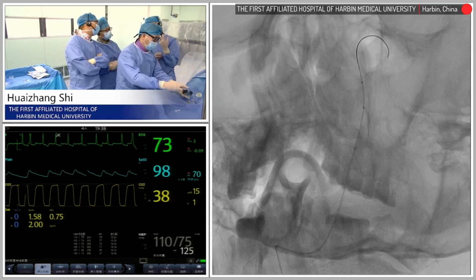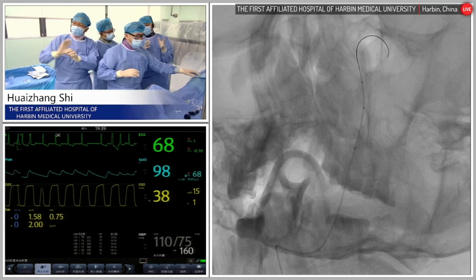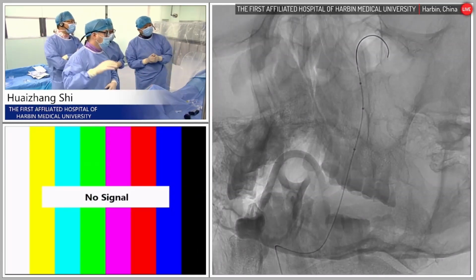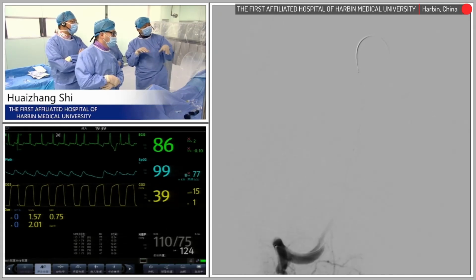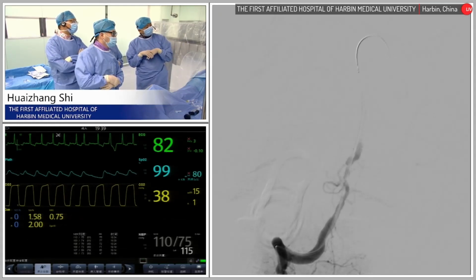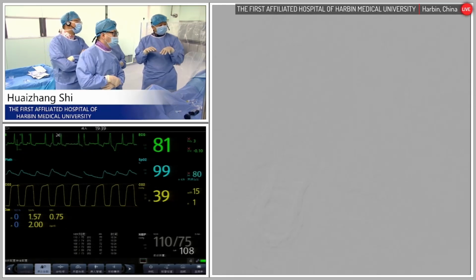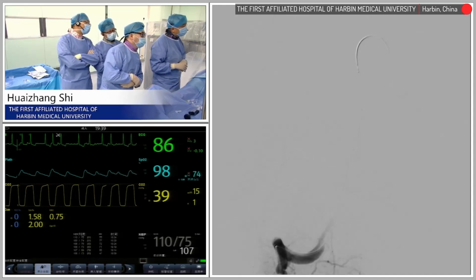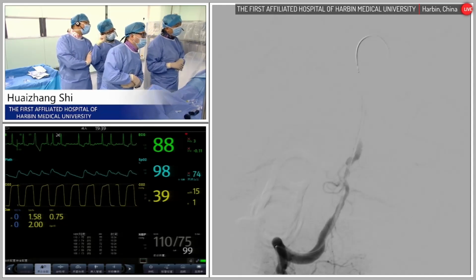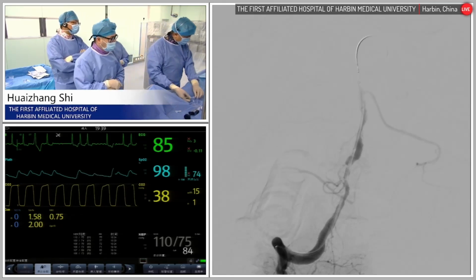So for the intracranial stenting, when we inflate the balloon, we should inflate very slowly, because it can decrease the dissection rate. Okay. What do you think, maybe angiography again, sir? No. I think it's good. Okay. Very good.